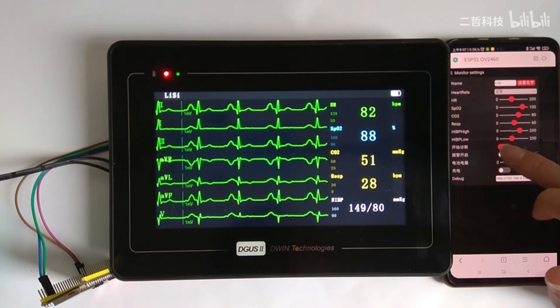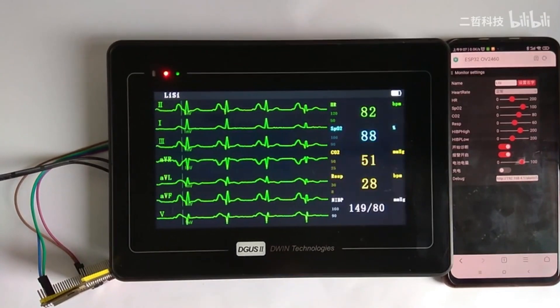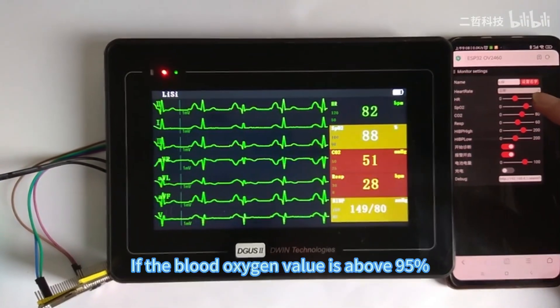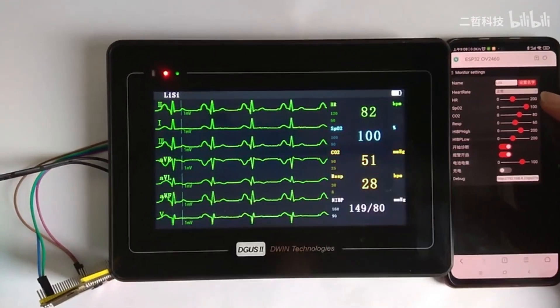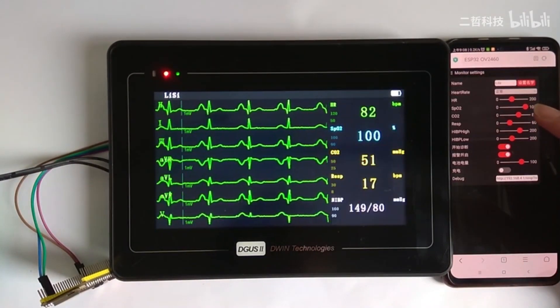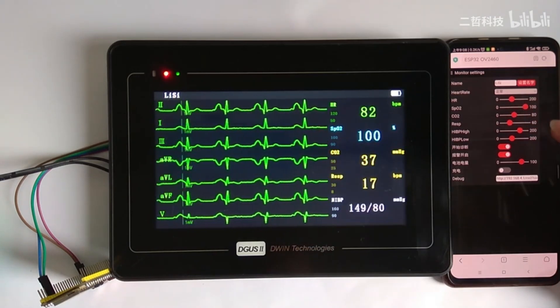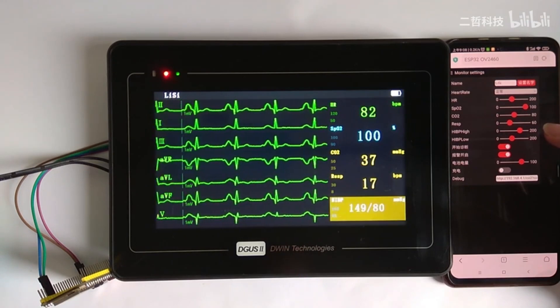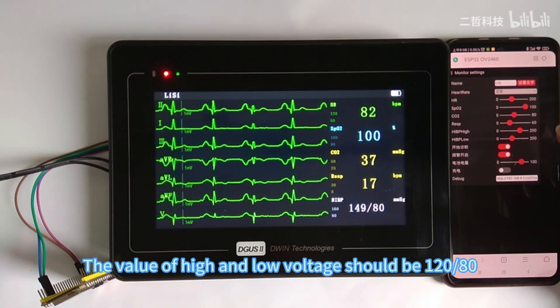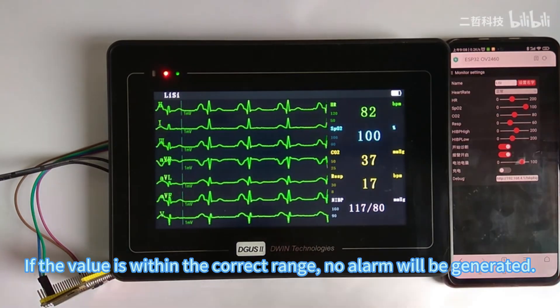An alarm switch is set here. When the alarm switch is turned on and a value is not within the normal range, an alarm will be displayed. We adjust the parameters to within the normal range: blood oxygen should be above 95, carbon dioxide should be between 35 and 45, respiratory rate should be between 12 and 20, and blood pressure should be 120/80. If the values are within the correct range, no alarm will be generated.